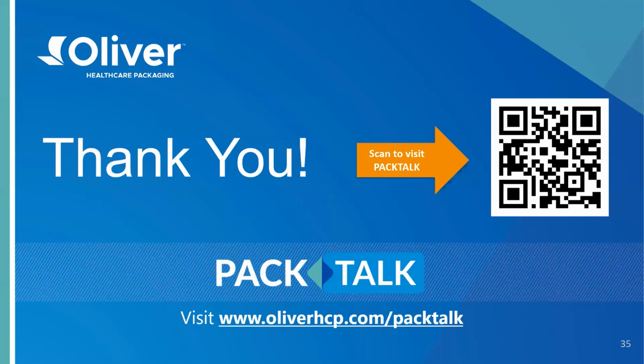Well, it's a big part of it. The way to ensure sterility of the device is via the primary packaging. So, if you don't ensure the usability of the packaging, you're really going to run the risk of your device not being accepted by the end user. So, really it's critical, and I mean critical, to ensure that your primary packaging usability is included in your study.